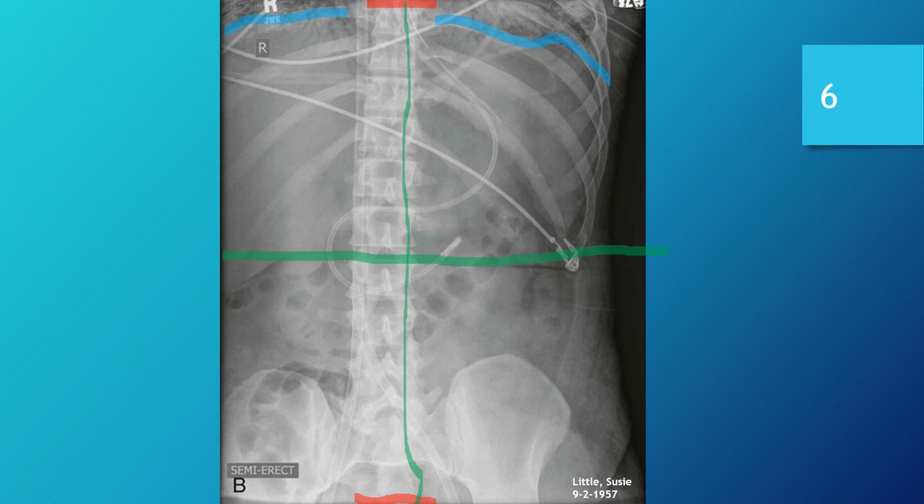Moving on, let's see. Does the image display adequate exposure properties? The contrast for this image is really good. We have some anatomy that is readily visible, things that we would expect to see in this exam. The inferior margin of the liver is present there. I really can't note too well the both psoas muscles.